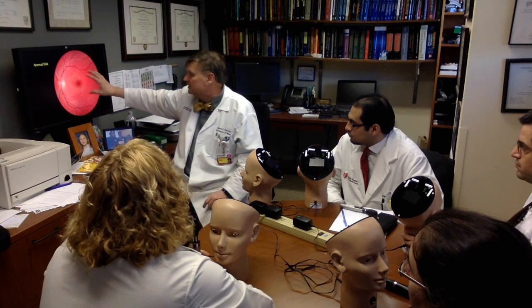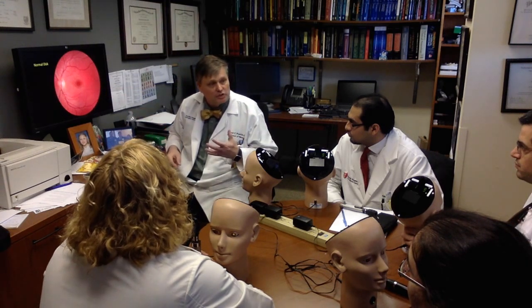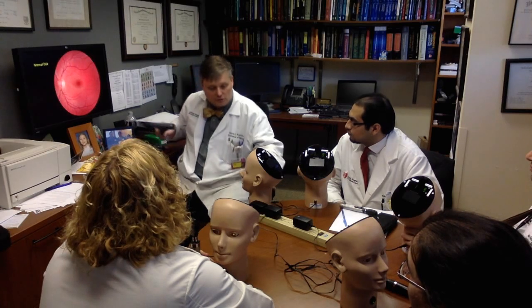But then the thing in the center that's pigmented, this is the macula where the fovea is, where central vision is, as you're going to see. So those are the important things to do. So let's do it again.